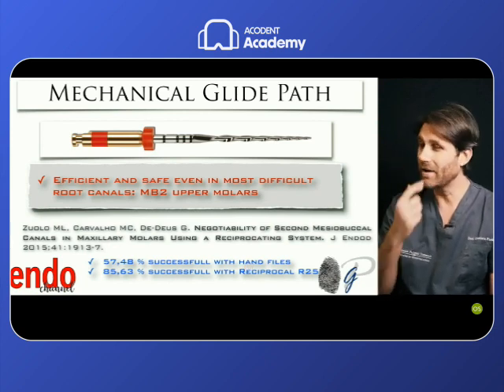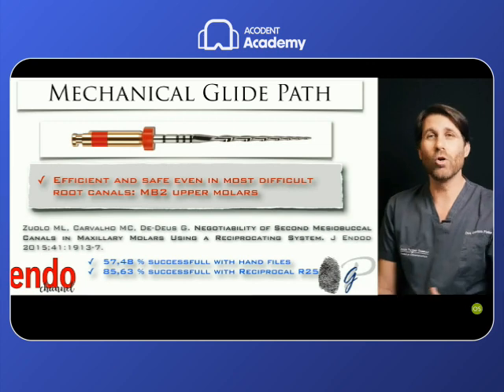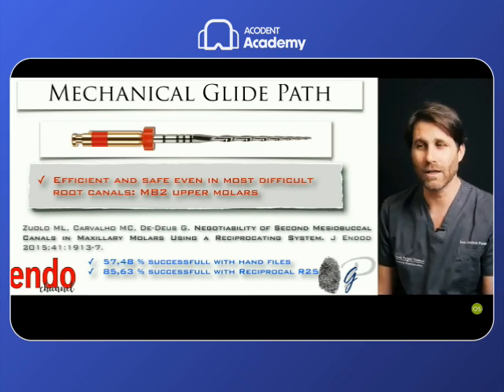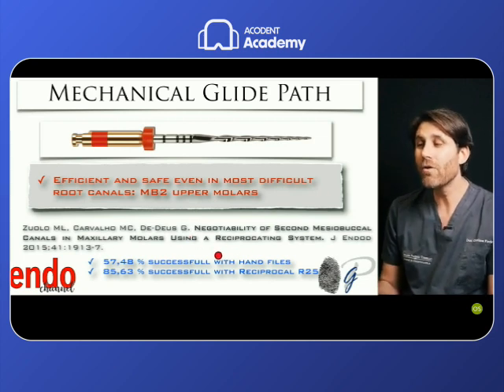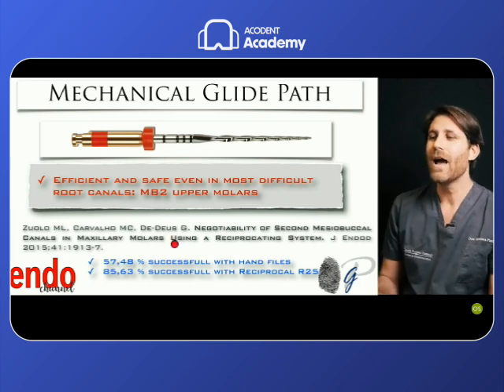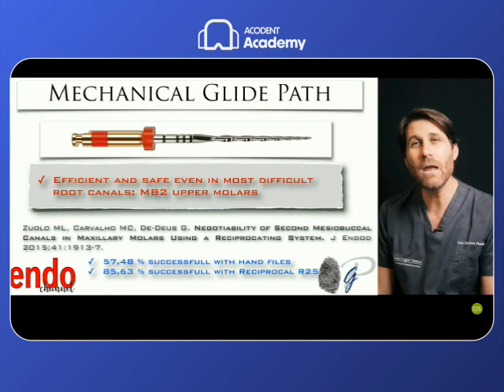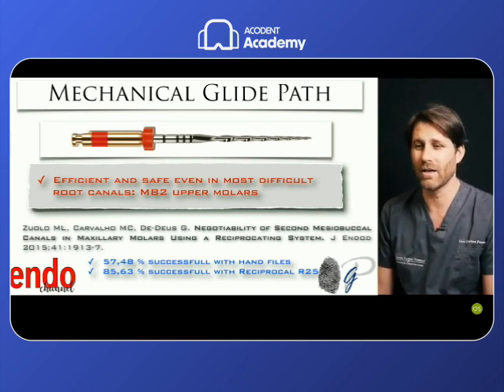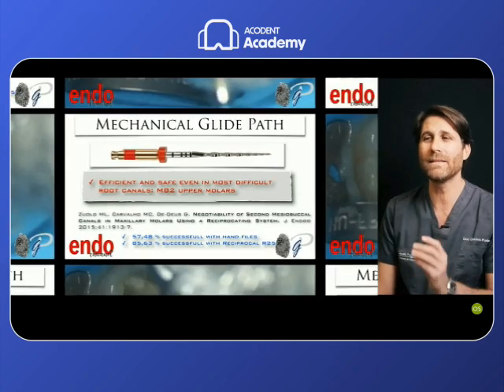So the difference is very big, and it's crazily surprising if you don't know the instrument and if you don't know the technique, because we are speaking about a manual small file 6, 8, 10 that is not able to scout a root canal, and a big file like a 25 taper .08 at the tip that is instead able to scout this very small root canal. So the difference is crazy, but this is what really happens clinically.